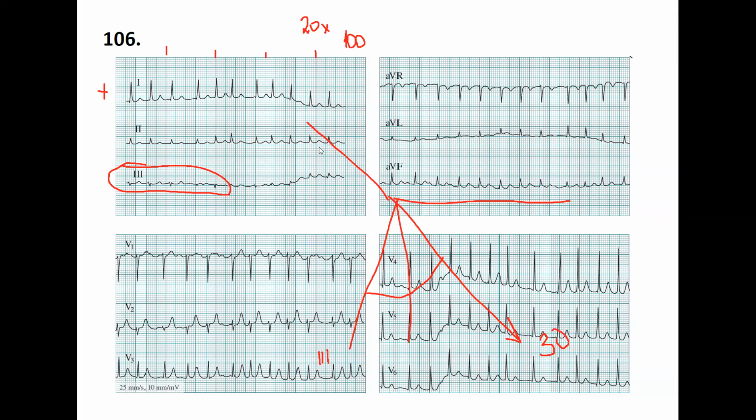Which one? AVR is plus 30 degrees, exactly, negative. So this is why you are choosing 30 degrees. Correct. Very good.